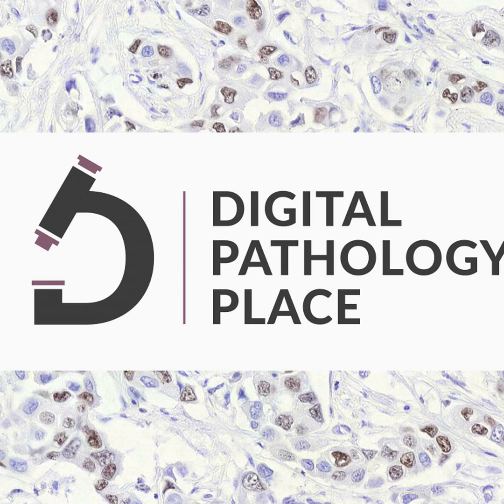And that means that what the peer review pathologist is doing, and currently you can read a study on glass and have a peer reviewer review it digitally. So their information is not really data, because data is my report. Only what I put in this report is data. So there is a little bit of controversy. Do we really need to retain those slides if it's only for peer review? There is a little bit of discussion in the industry because we currently don't do it.